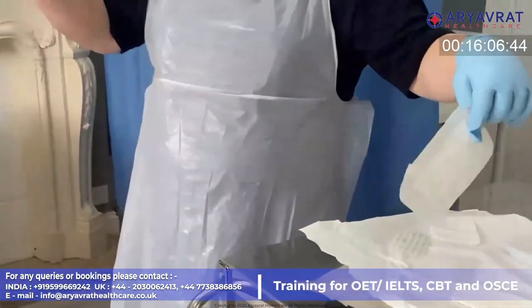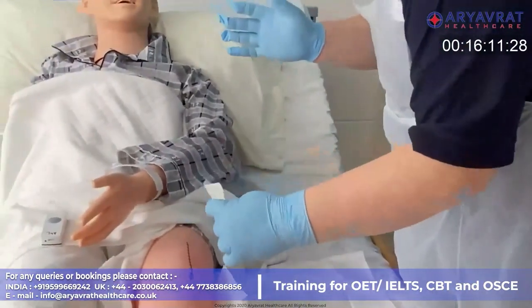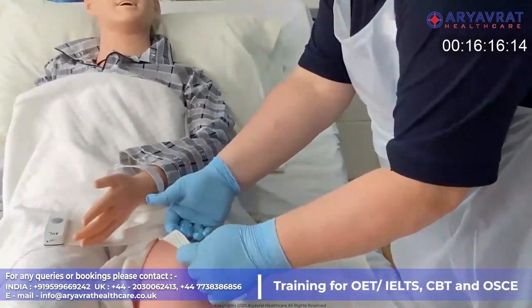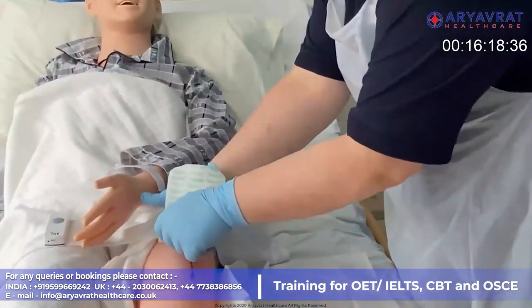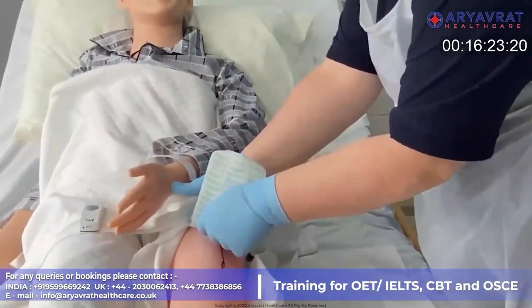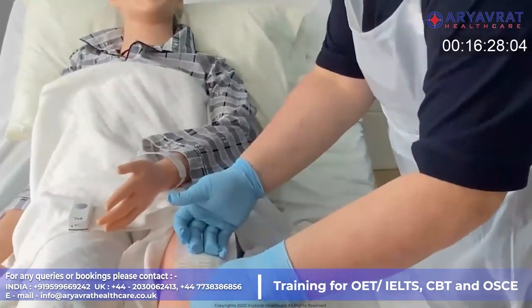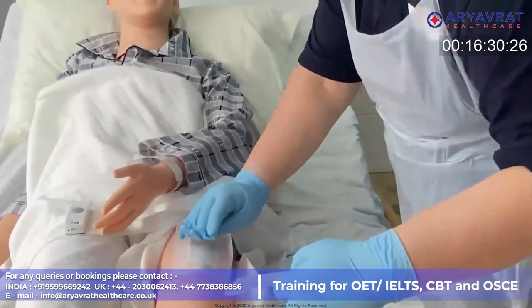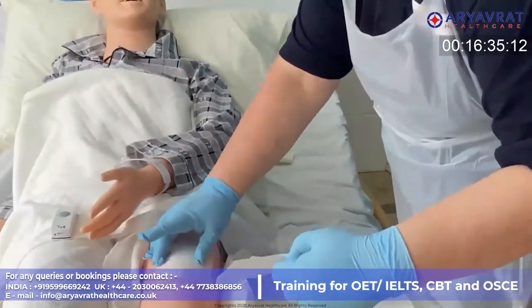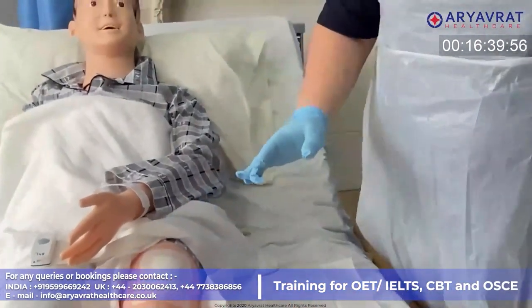And making sure that my dirty hand only goes on the outer aspect of the dressing, I am going to place this over the wound, securing it with the back of this hand, so it's my clean hand that's going near the wound to take off the final dressing backing. And I'm going to secure that on here, making sure that there's no creases on there. That's done, Raj. Oh, that's good.